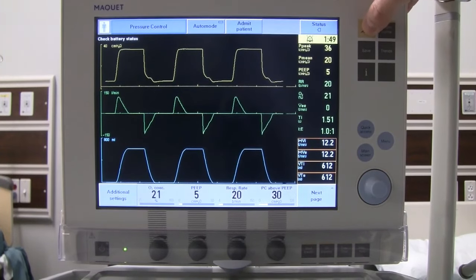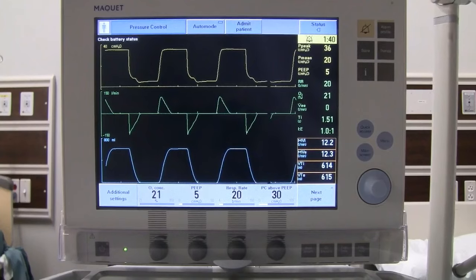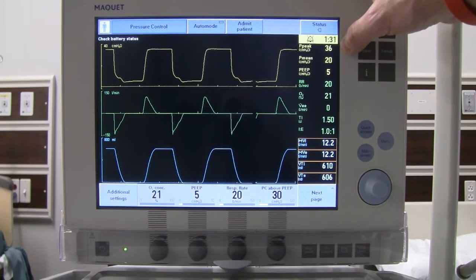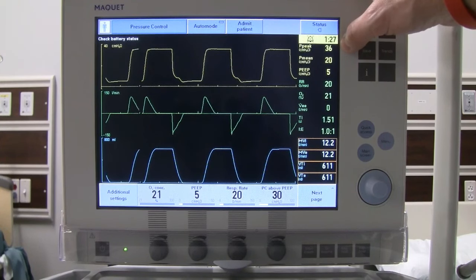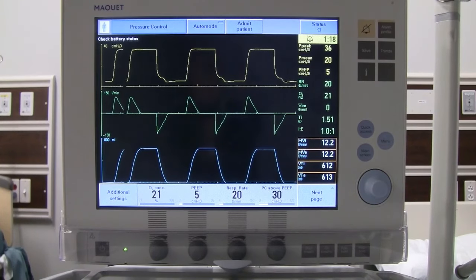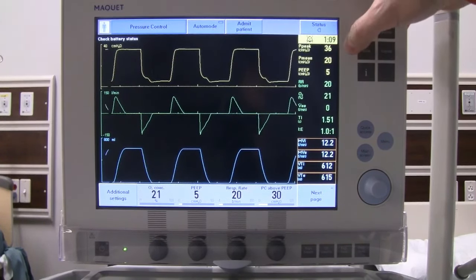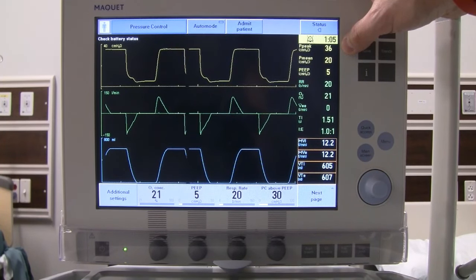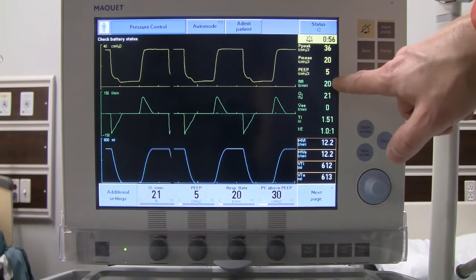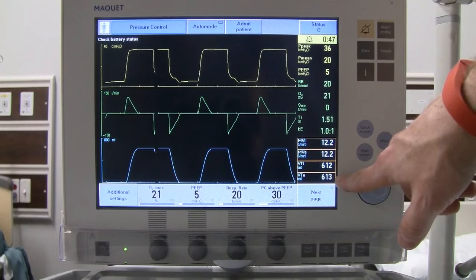Now the patient is ventilating in pressure control. With pressure set at 30 plus PEEP of 5, peak pressure reads around 36 — about 1 cmH2O above what we set, likely due to tubing or calibration. Mean pressure is 20. If we're trying to protect the lungs, we won't target the same volume as before — that's why we increased the rate. With the higher rate, we can tolerate a smaller tidal volume while maintaining adequate minute ventilation.